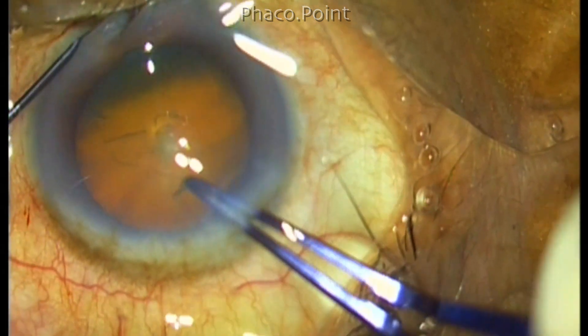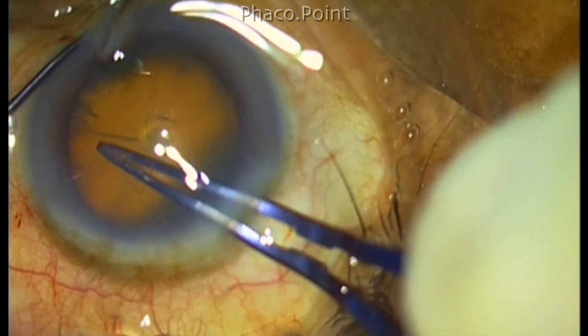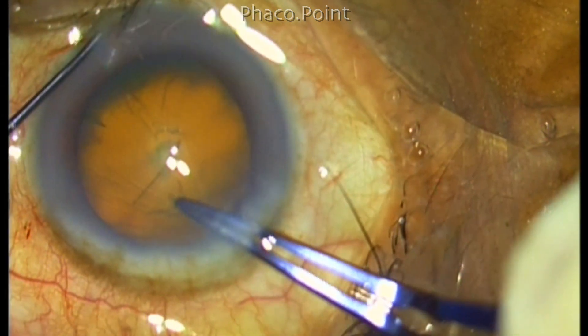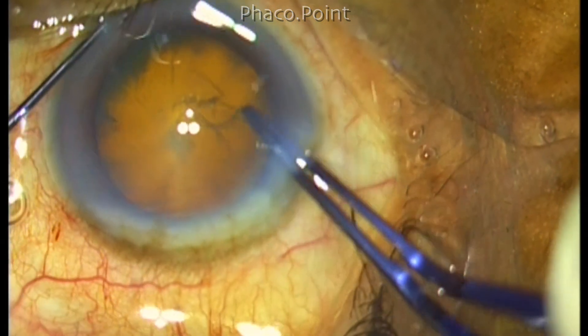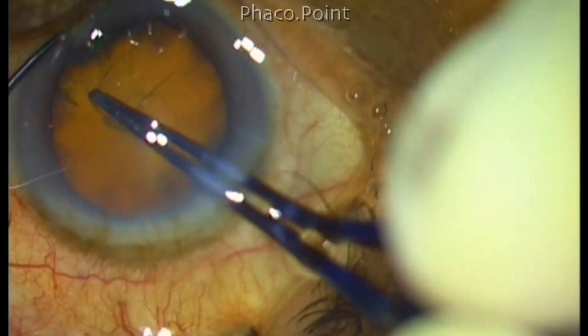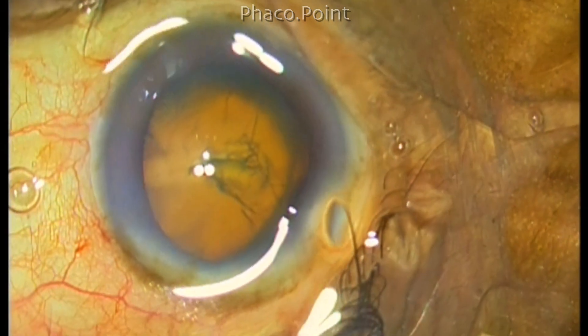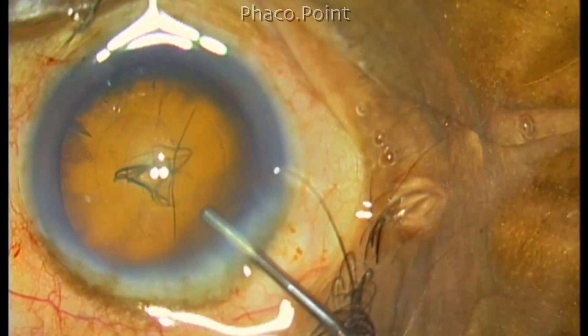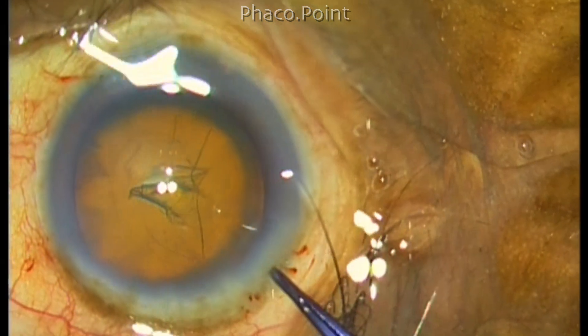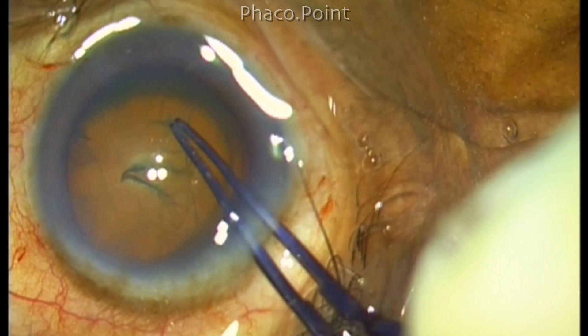So the capsulorhexis is being performed. This is a grade 1 to 2 nucleus sclerotic cataract and using a Utrata titanium forceps, I'm creating a quite well-centered 5.5 millimeter capsulorhexis. Once the capsulorhexis has been achieved with the need to re-insufflate the anterior chamber with viscoelastic, I proceed with cortical cleavage hydrodissection.